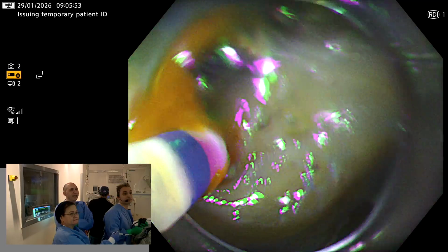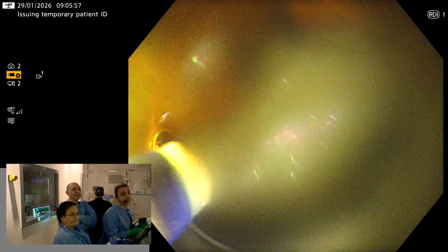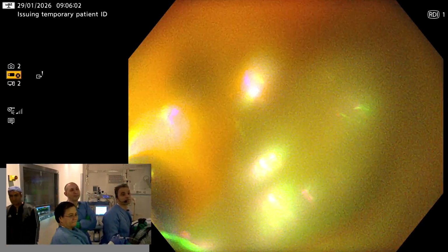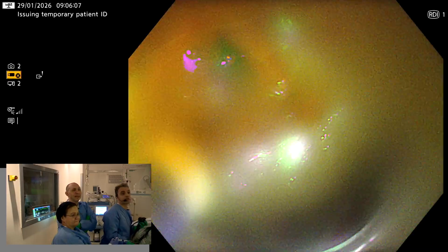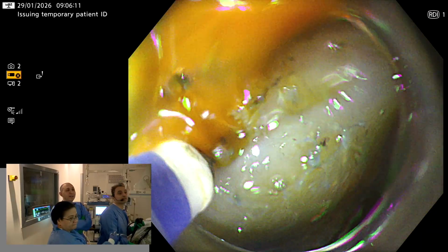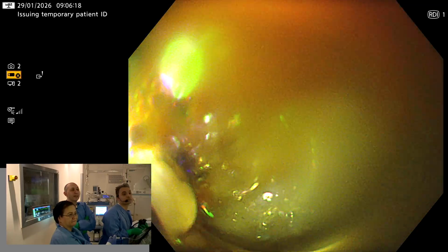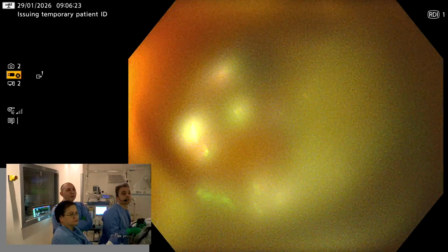As we know, the stomach is a very vascular organ, and we are expecting a larger vessel in the submucosa, especially at the prepyloric region and at the cardia, subcardiac region. And here, in this case, we could try to coagulate with the needle tip with either soft coagulation or spray coagulation, depending on the size of the vessel. If not, we could go for the coag grasper.